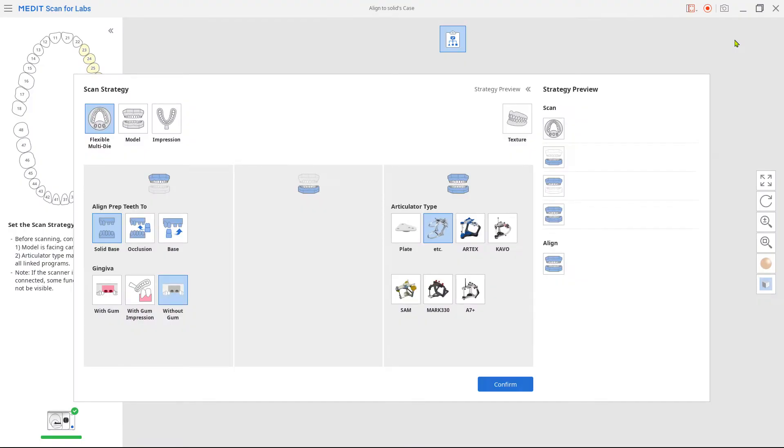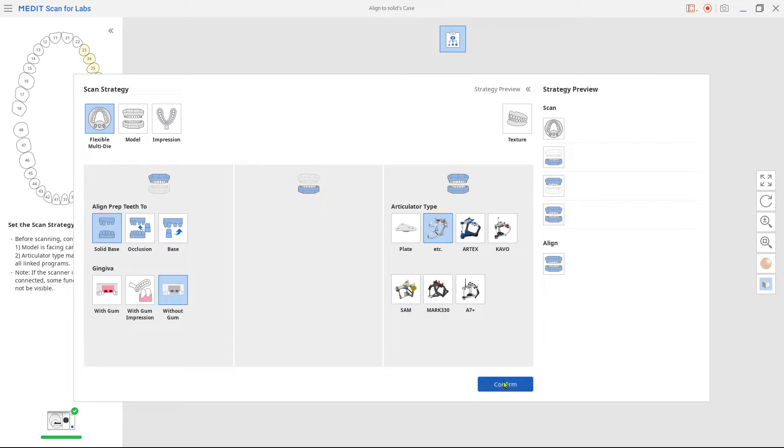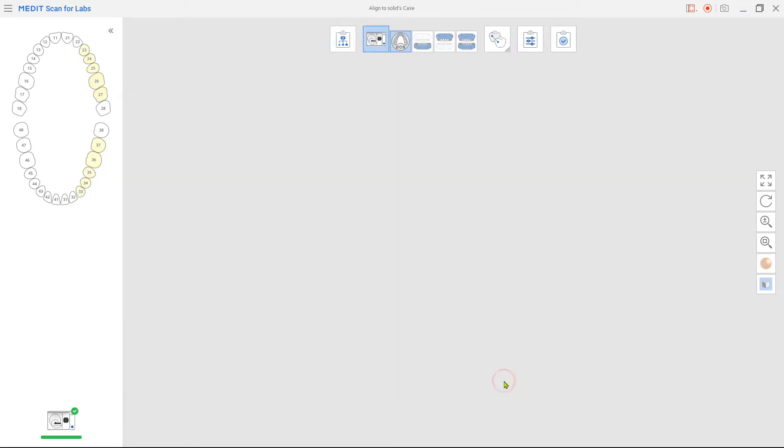Choose the flexible multi-die, align prep teeth to solid base and gingiva option for maxilla and mandible if needed. Choose Etcetera for the articulator type and click confirm.